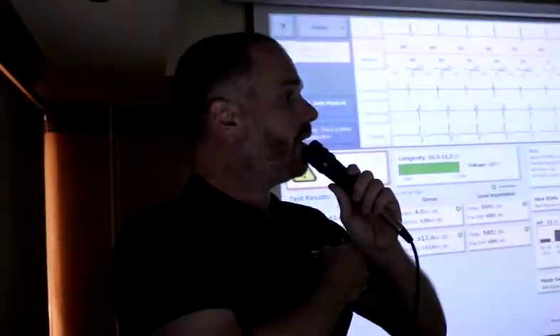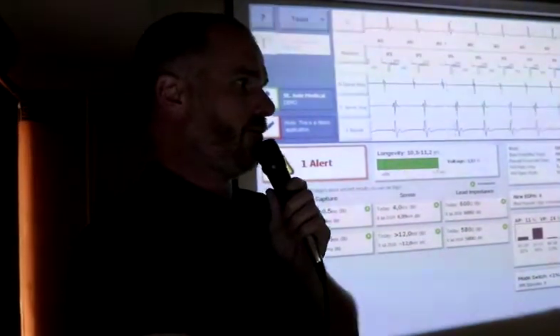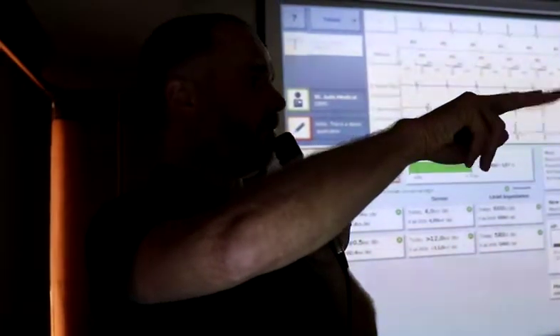How come this is intracardiac? Yeah, it's clever. It goes into unipolar mode and measures from the tip to the can, and we can see left atrial activity. That's clever, right? So then you can measure your P-wave duration intracardiac.